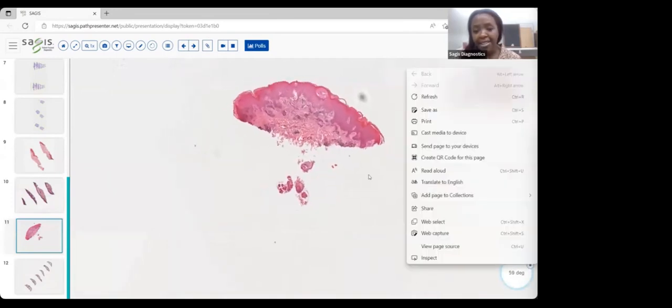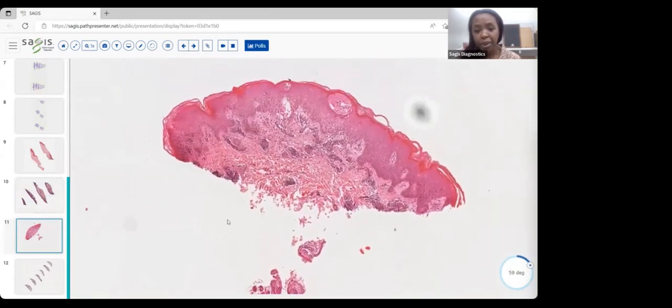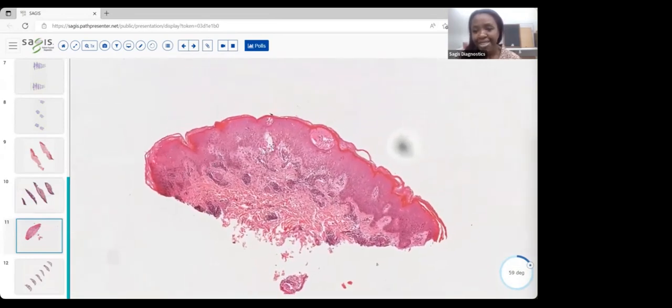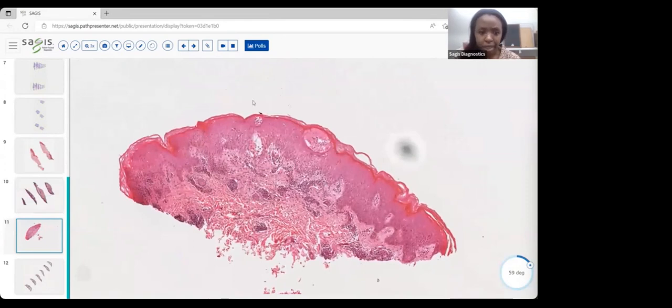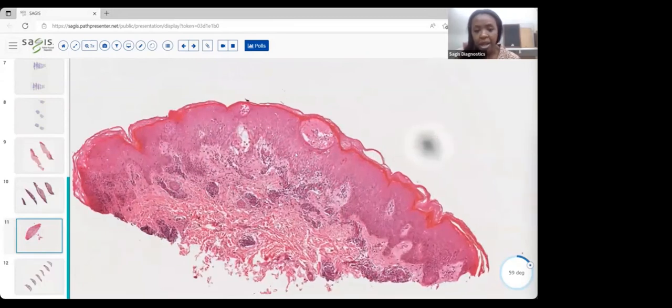And then this case, just to make the point, including it, this is so non-specific, and that's really kind of the point. You have this papule, you have some compact hyperkeratosis, and then obviously you have vesiculation, right? So you have background spongiosis, and you have this vesiculation with some polys running in there and a bit of a superficial perivascular and interstitial inflammation, right? It's a bit of a mixed pattern there.